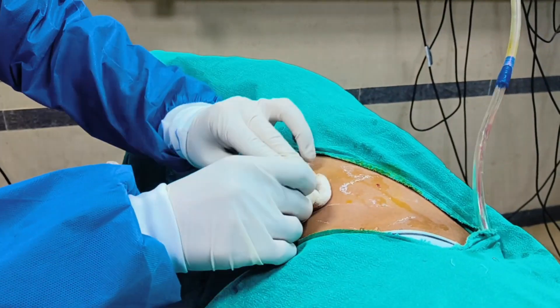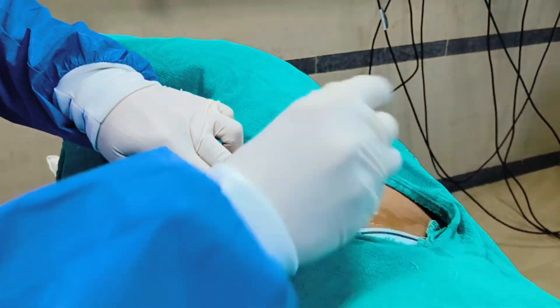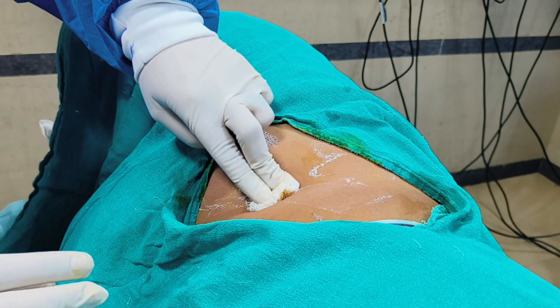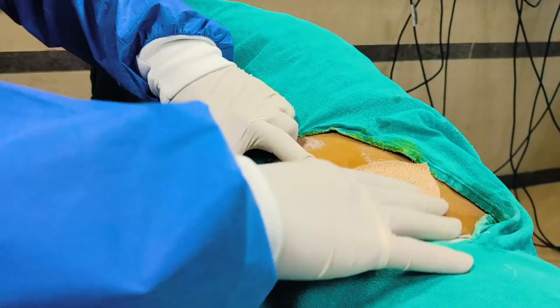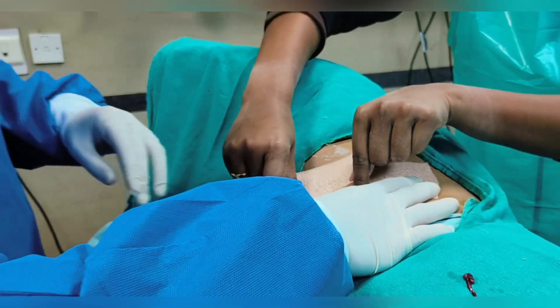We will clean the surrounding area with dry gauze. We have to compress the ICD site so air should not go inside due to negative pressure. Now we will stick dynoplast — one on the lower side and one on the upper side. Our procedure has now been completed.